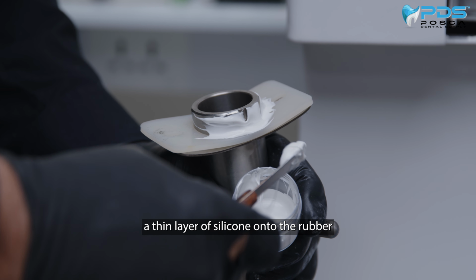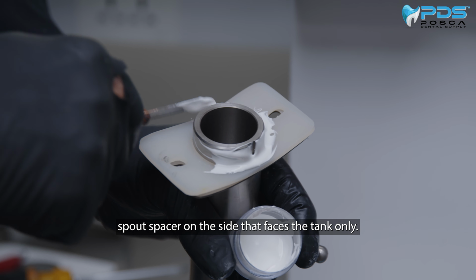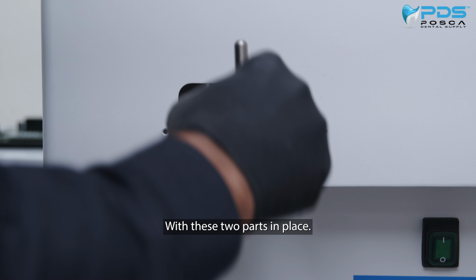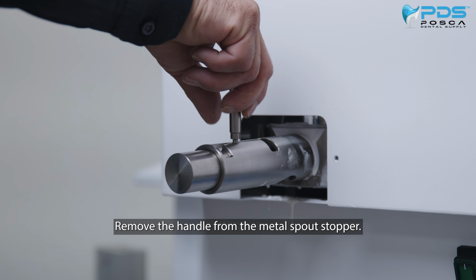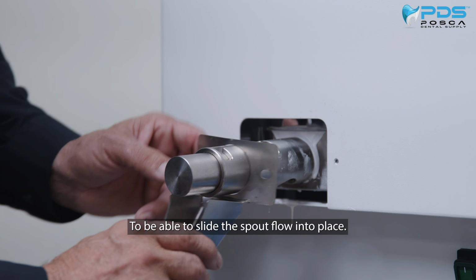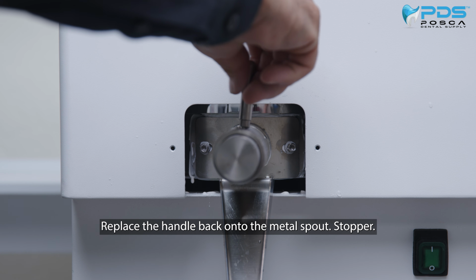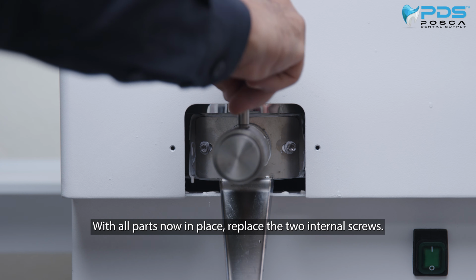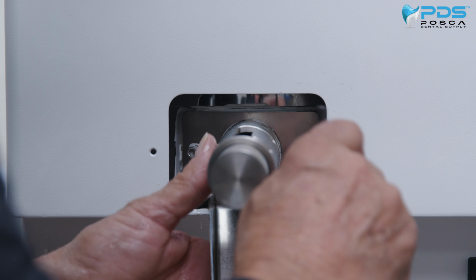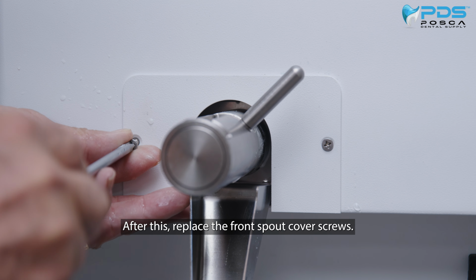Place a thin layer of silicone onto the rubber spout spacer on the side that faces the tank only. Replace the rubber stopper and spout on the unit. With these 2 parts in place, remove the handle from the metal spout stopper to be able to slide the spout flow into place. Slide this part onto the spout, replace the handle back onto the metal spout stopper. With all parts now in place, replace the 2 internal screws. After this, replace the front spout cover screws.